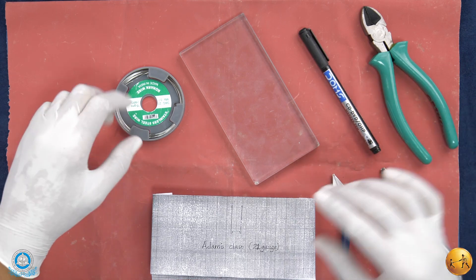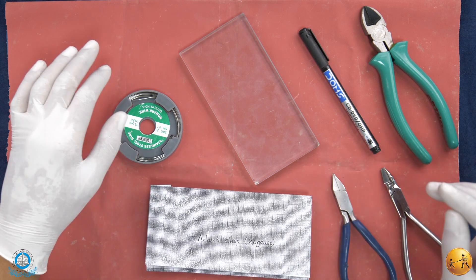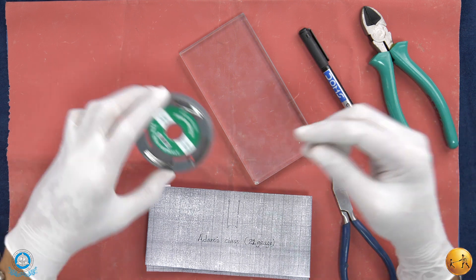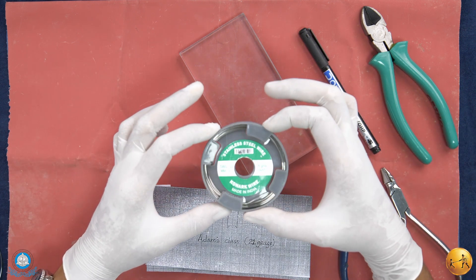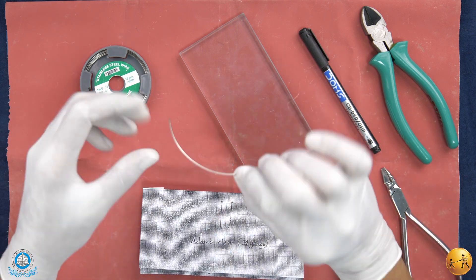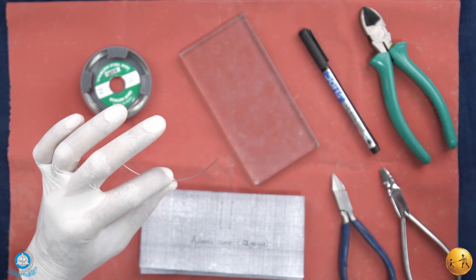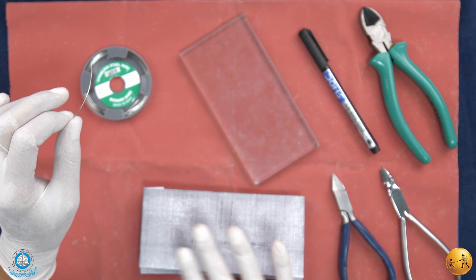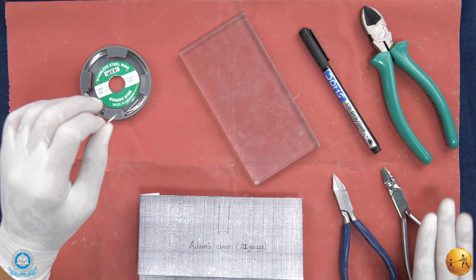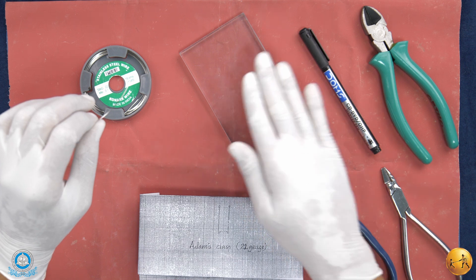Let's discuss the fabrication of the Adams clasp. The Adams clasp is used for retention and is made with a thinner gauge wire compared to a C or U clasp. It's made with a 22-gauge wire, so you need around 8 to 10 centimeters of 22-gauge wire. For the on-plane Adams clasp, you need an Adams plier, a universal plier, a wire cutter, a permanent marker or glass pencil marker, and a glass slab.